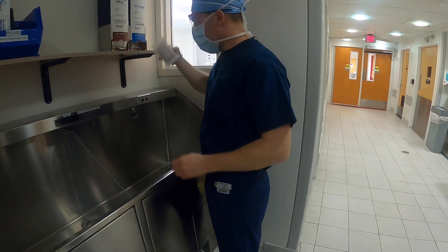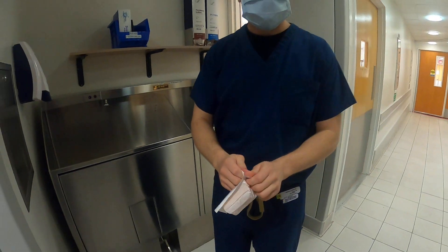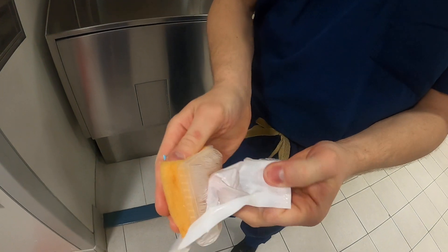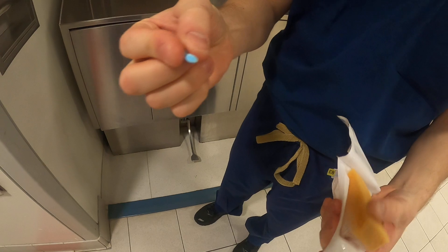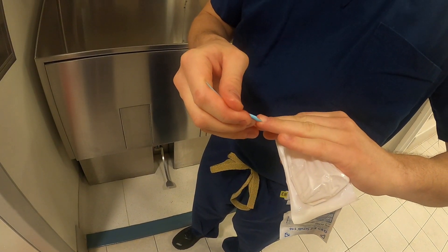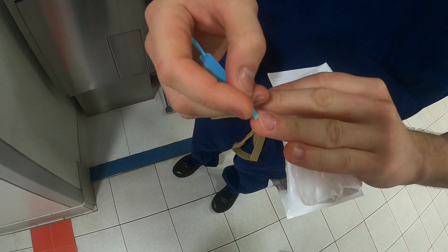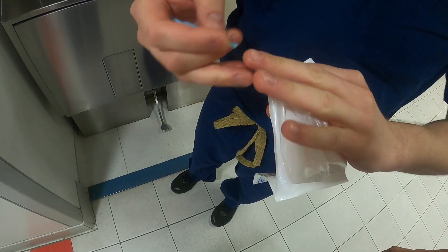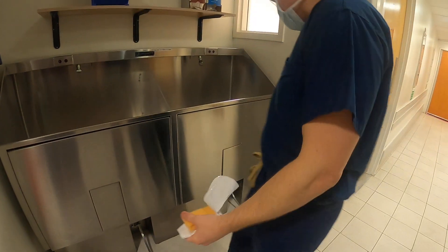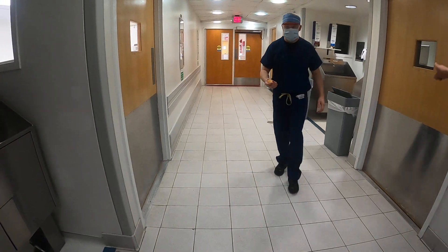Once you open up a scrub pack, peel it open and you have your sponge with bristles and your nail pick. Find a nail that has a little bit more under it and scrape underneath — this gets done first, prior to scrubbing. Get everything out from either side. Or you can just keep your nails really short. After this, there's usually a trash can right here — throw the nail pick away and put your wrapper away.